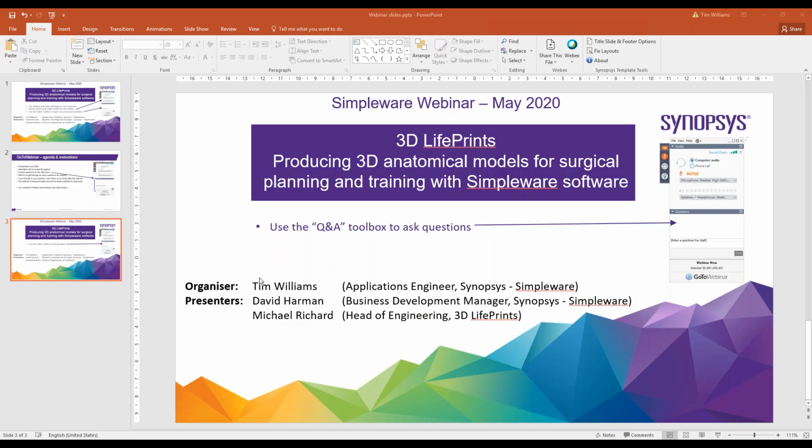Okay, perfect. Thank you. We've got a few more questions that have come through. This is another question saying, thank you for the great webinar. This is regarding the tumor case. If they've heard correctly, does Synopsys use an automated tool for the tumor segmentation? Perhaps you could go over the details you used for the segmentation steps again.